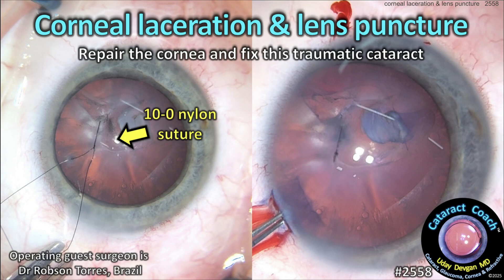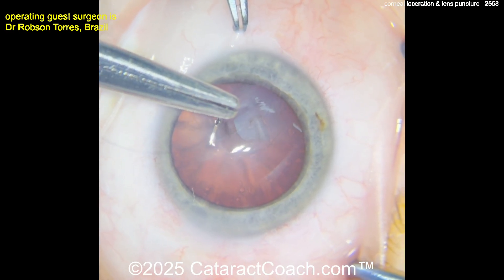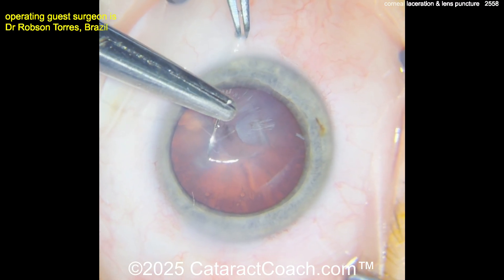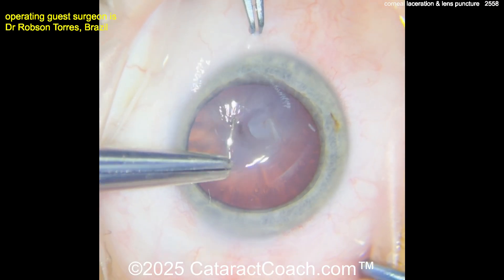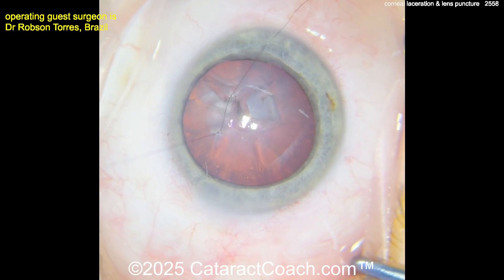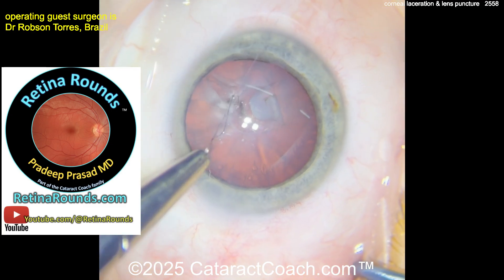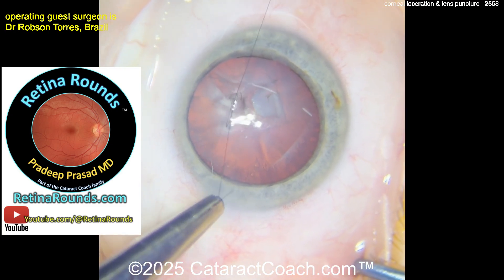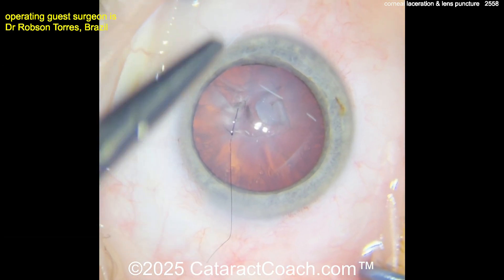From cataractcoach.com: corneal laceration and lens puncture — we need to repair the cornea and fix this traumatic cataract. This looks like a pretty young patient. You can see there is definitely a corneal laceration here, so using 10-0 nylon and closing that laceration. Fortunately for the patient it's not right in the center of the visual axis, but it will still induce some irregular astigmatism as you suture this shut. Check out our sister channel retinarounds.com for information on ruptured globe cases.